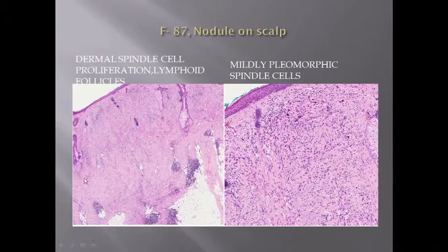So when scanning magnification of this lesion, you sometimes wonder, oh yeah, this could well be a scar. Particularly when somebody reaches that age, there could be plenty of reasons why you should or shouldn't have a scar on the scalp. It could be a previous folliculitis, or some BCC removed, or some actinic keratosis removed earlier. And the patients themselves may not think it had happened. So you will never be able to guess that this is something nasty unless you look carefully. And this is such a very blunt looking, ill-defined lesion.